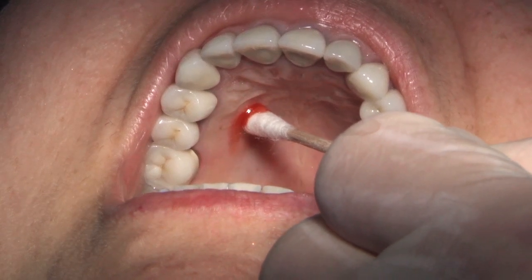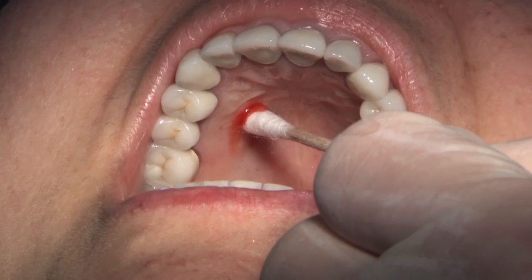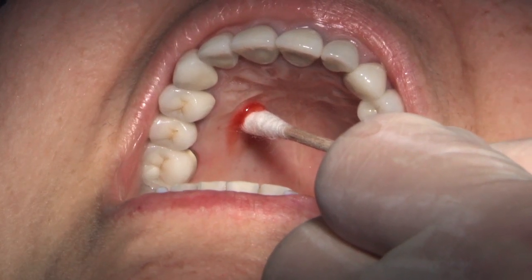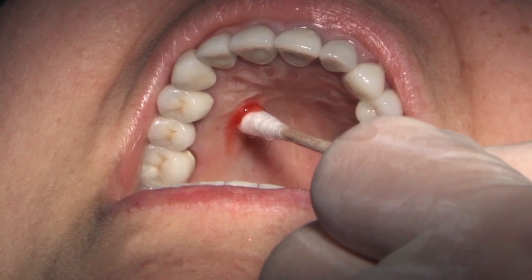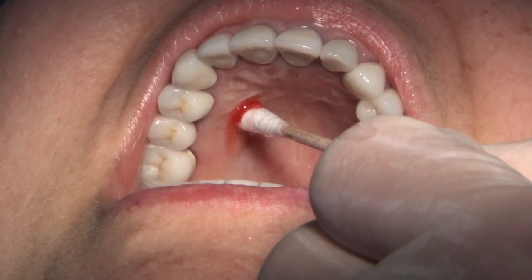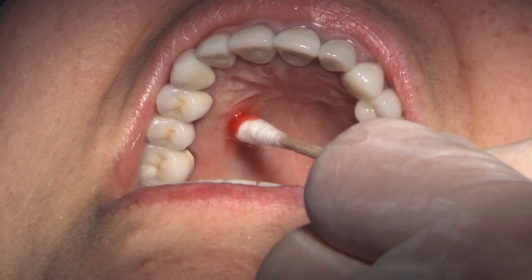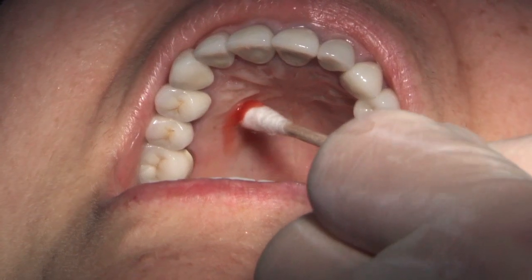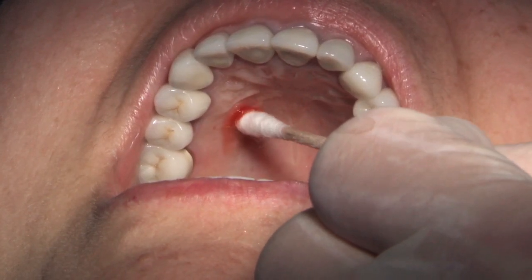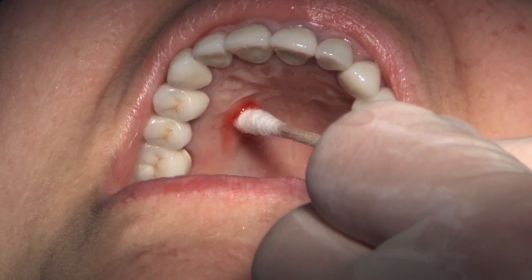It's right in there. We're using a more traditional approach — we're going to apply the topical and then follow it with some pressure on the site, which is a common approach for the palate. When I say the more typical approach — this is using topical versus the no-topical approach that you can do with the wand using just pressure instead.